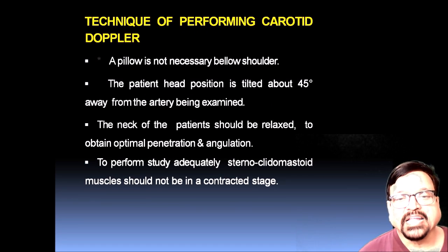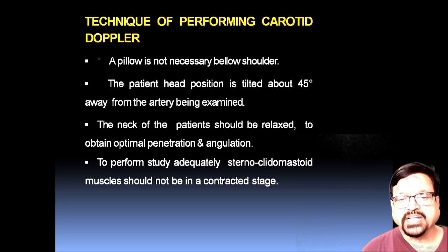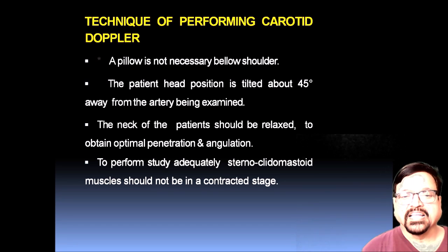Now, the technique of performing carotid Doppler. A pillow is not necessary below the shoulder. Sometimes if the neck is short, if the patient has difficulty in extending, then the pillow is necessary. So the option of the pillow depends on the patient's neck position. However, it can be used as a routine also.